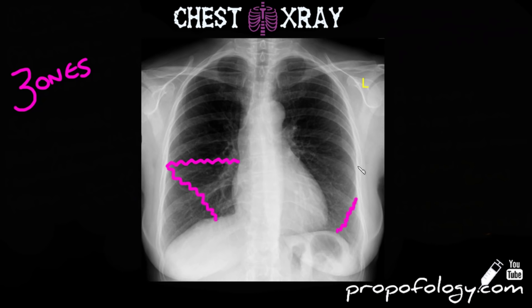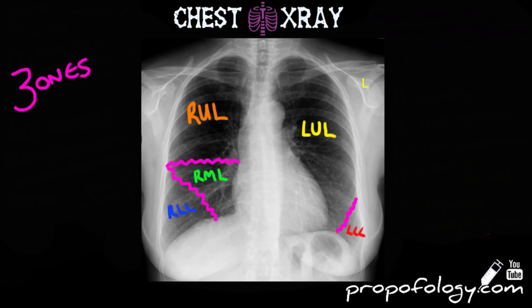There are two lobes on the left and three lobes on the right. On the right we have the right upper lobe, the right middle lobe, and the right lower lobe. On the left we have the left upper lobe and the left lower lobe. The lobes aren't exactly equal thirds of what you see on screen, which is really important when identifying structural abnormalities or pathology. For example, what you might think is the right lower lobe is probably the right middle lobe — the right lower lobe is much more lateral, because for the most part it is posterior to the middle lobe. The same applies to the left lower lobe relative to the left upper lobe.